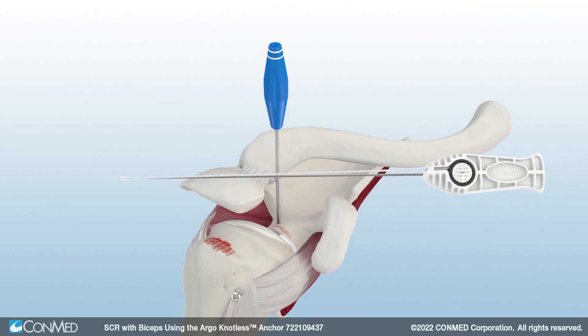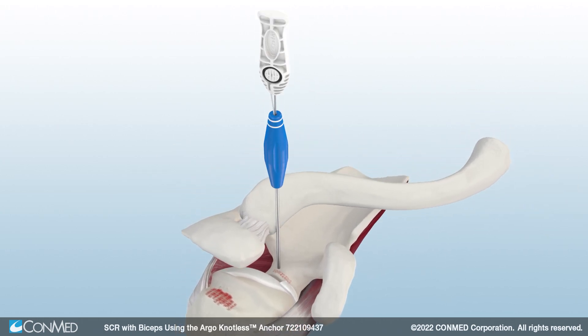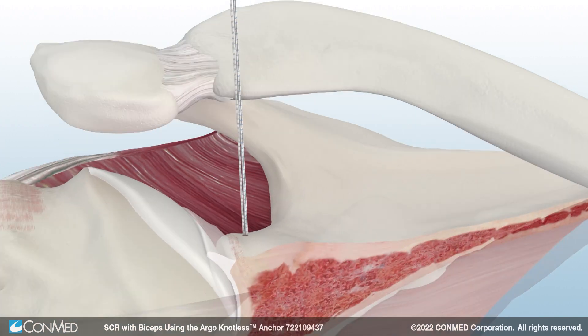Then, insert the Y-Knot ProFlex with HiFi Ribbon All-Suture Anchor. Remove the driver, which uncleats the sutures automatically. Set and deploy the anchor by pulling back on all the suture limbs and remove the guide.